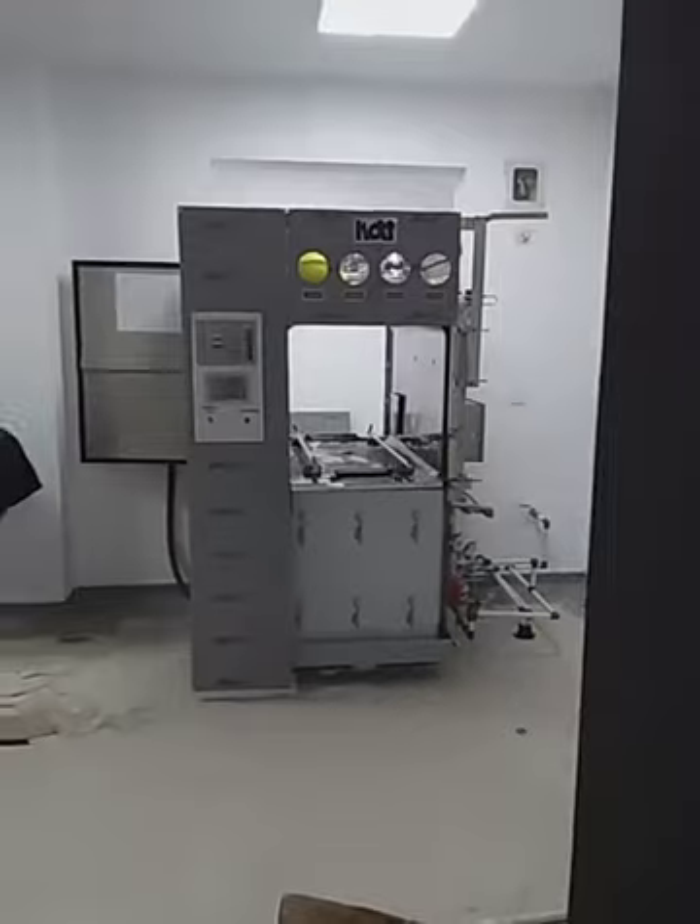Today I am in Nairobi, Tibetan Hospital. Here I came for installation of these two machines.